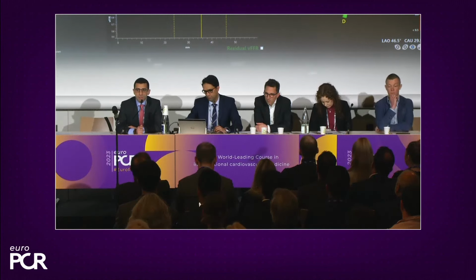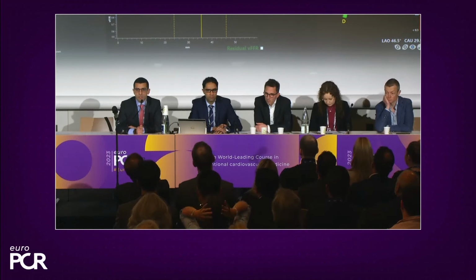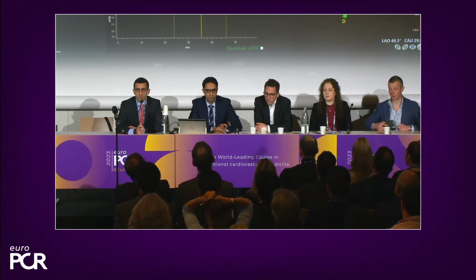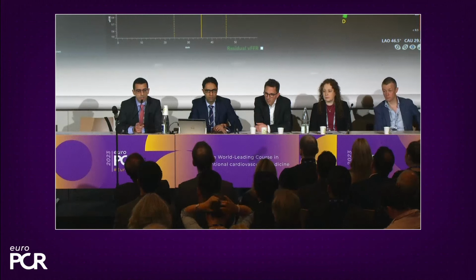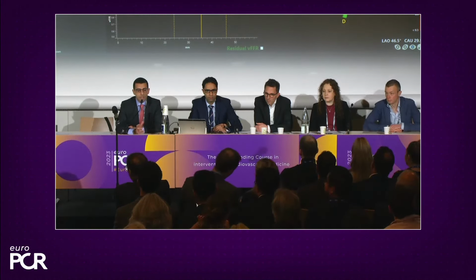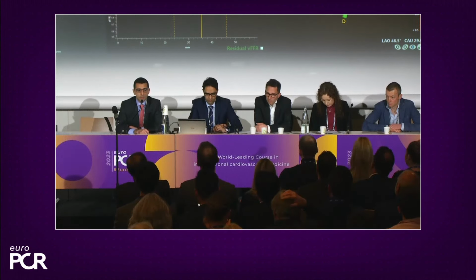And that is something which is becoming more and more important nowadays, because we can recognize if there is a focal lesion, which you may easily fix by a stent implantation, or if there is a diffuse disease. And playing with this screen, you may also plan your PCI, so where the stent should go, the landing zone, etc. So in one shot, you have FFR, and also the pullback for planning your PCI.